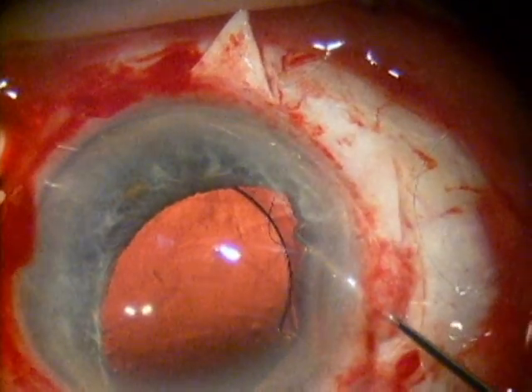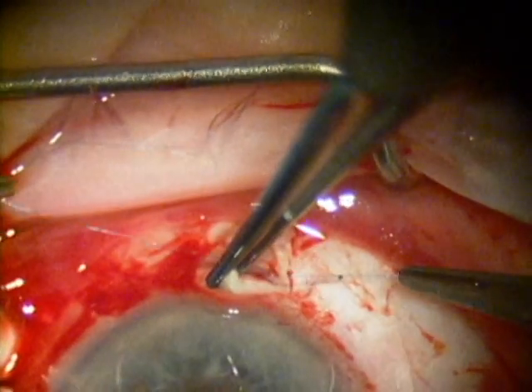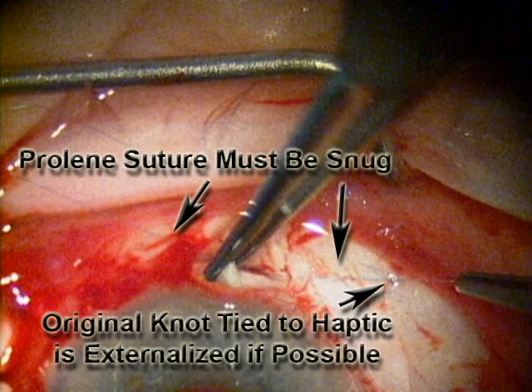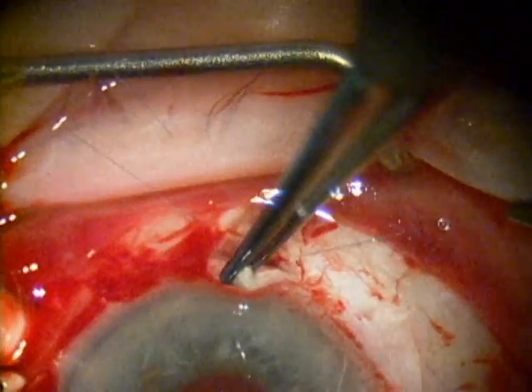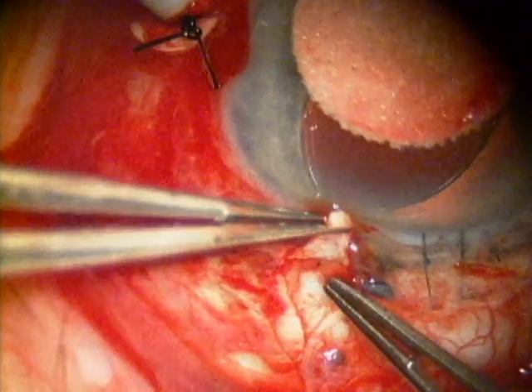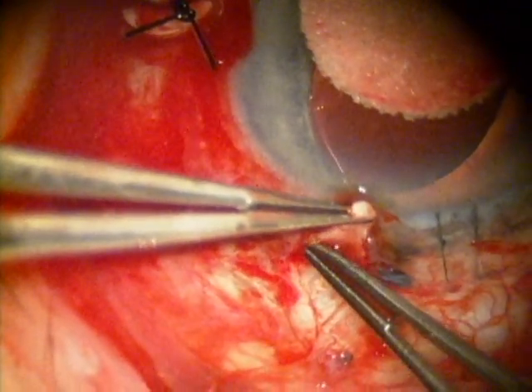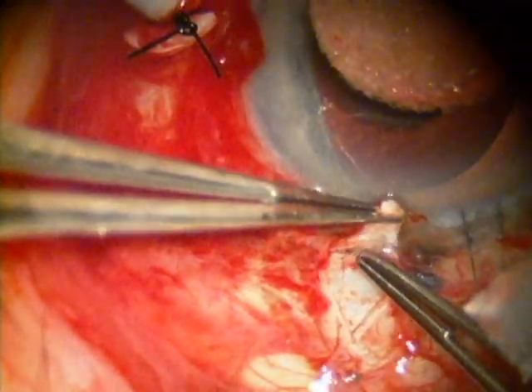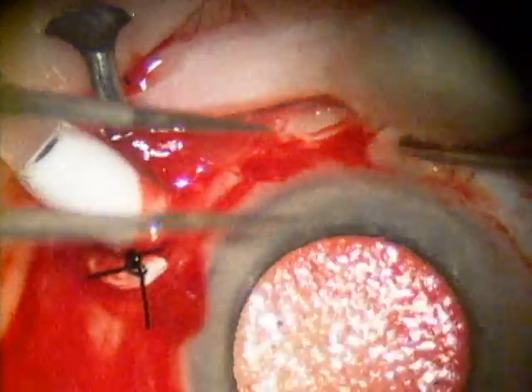Care is taken to place the flaps as close to 180 degrees apart as possible. This lens is a little bit decentered nasally but the optic is well within the visual axis. These prolene sutures are tied fairly tight but care is taken not to break the suture. The superior suture I was able to move and was therefore able to rotate into the eye. The inferior suture was not movable and therefore rather than risk breaking the suture, I buried it under the flap.